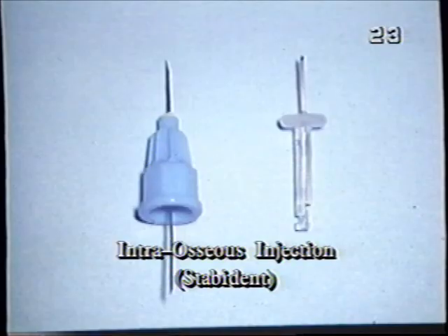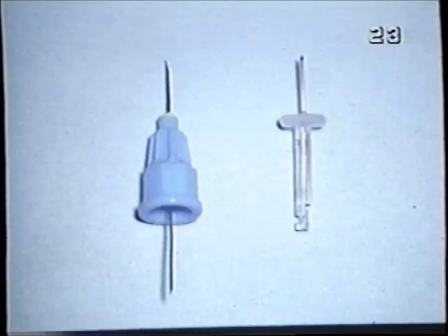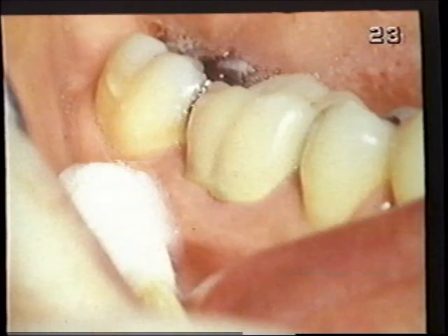The kit is composed of a few different things. Here you see the drill on the right and the needle on the left. The needle being very short. The drill doesn't really look like a drill. You can see a stop there. First thing I do is to use topical, as Malamed points out, with a good minute or minute and a half of placement of the topical anesthetic. You can get 2 to 3 millimeters of anesthesia.